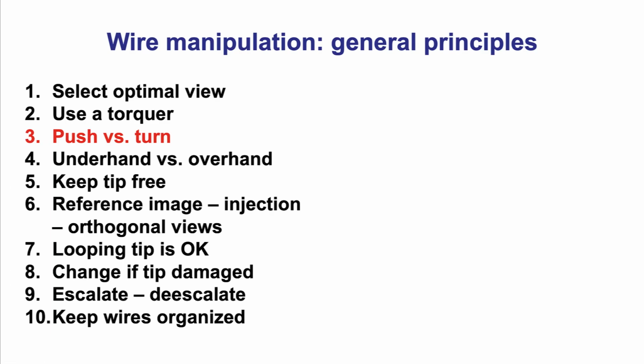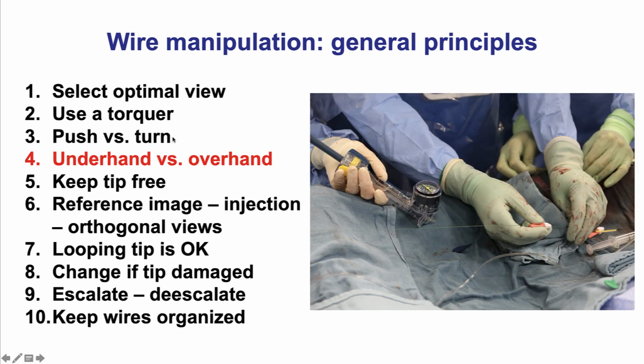The third key concept is about the balance between pushing and turning, and this is something that is gained through experience. In general, one wants to turn more and push less to be able to deliver the wire without damaging the wire or causing vessel injury.